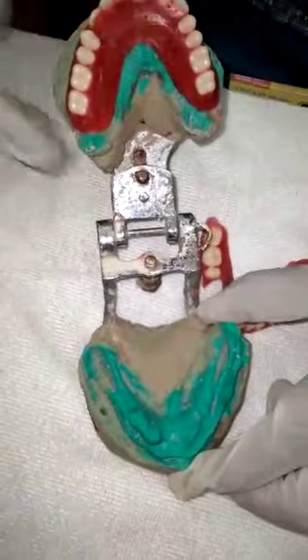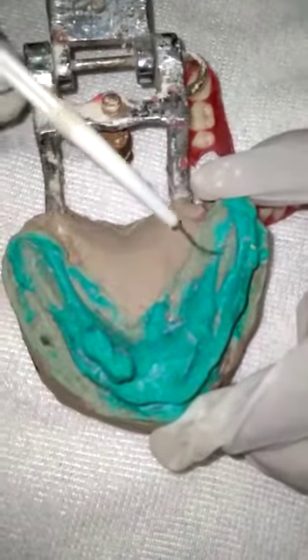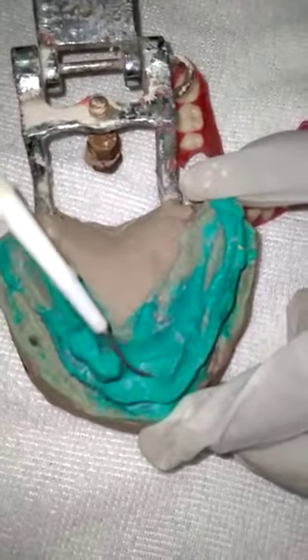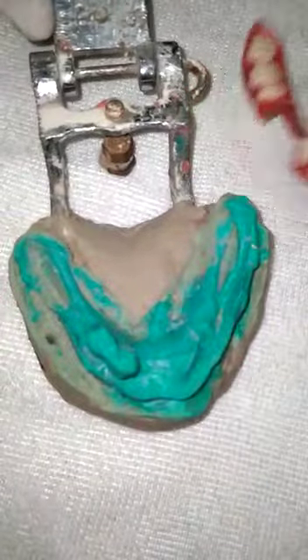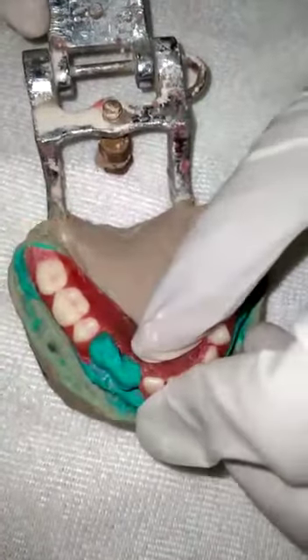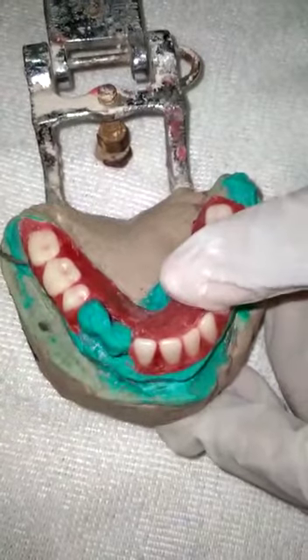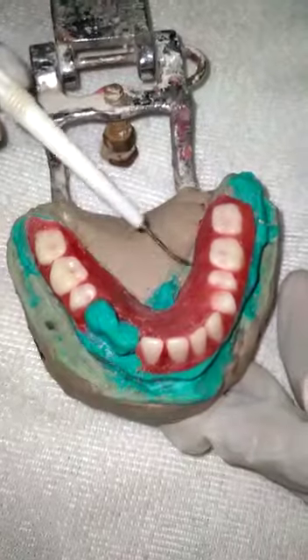In the lower, you can see the ridge was not clear. I think there are root systems here, and this ditch is also not complete. This area has a good ridge, but they are not having any ridge here, so we have made the denture only till here.